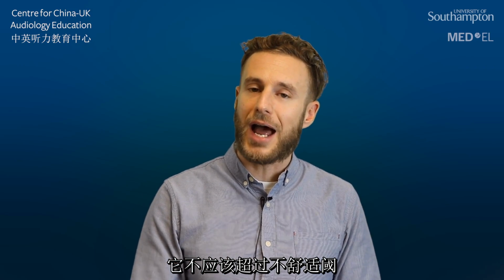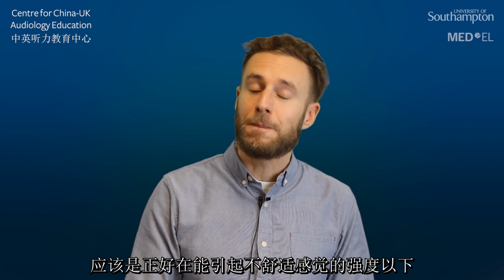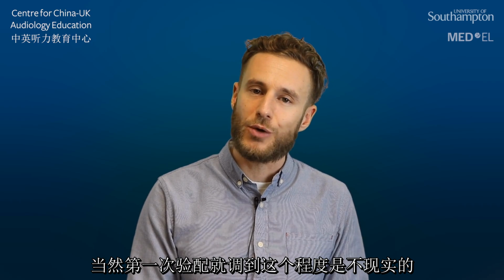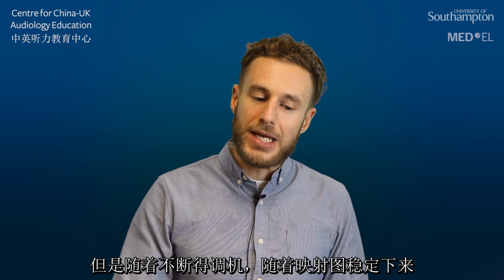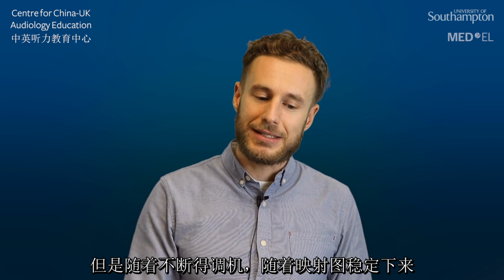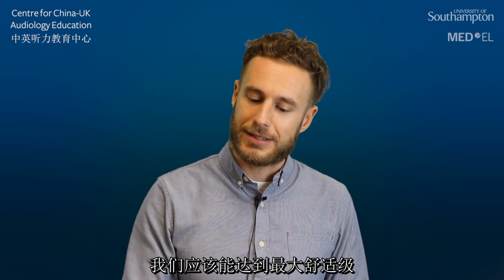It's not supposed to be above UCL, uncomfortable level. It should ideally be right below. For sure, you won't be able to achieve that in a first fitting, but when the hearing performance progresses and the map stabilizes, the MCL should create a strong and loud hearing sensation.